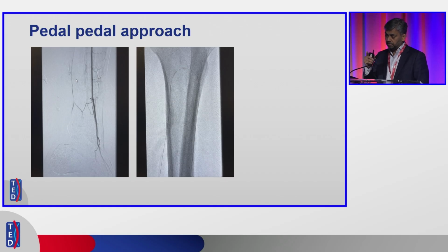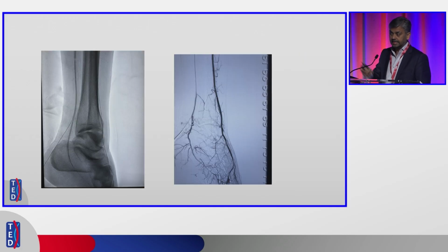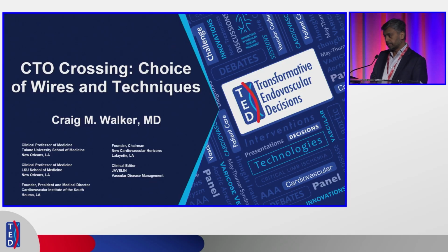Here, I've stuck a diseased posterior tibial artery, went up and around into the anterior tibial, and was able to revascularize the entire pedal loop. And in that case, your entire anterior tibial artery can revascularize the whole foot just from one pedal access. So all in all, it's great. Minimal access, minimal invasiveness, patient comfort, ambulation, these are the key. And I would thoroughly recommend that these accesses be incorporated into your practice. Sorry for going overboard on time. Thank you so much.